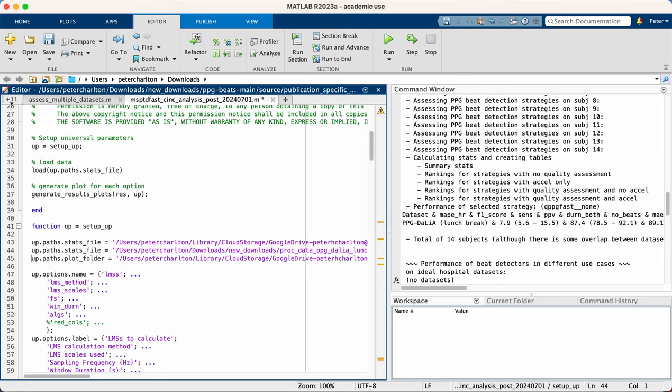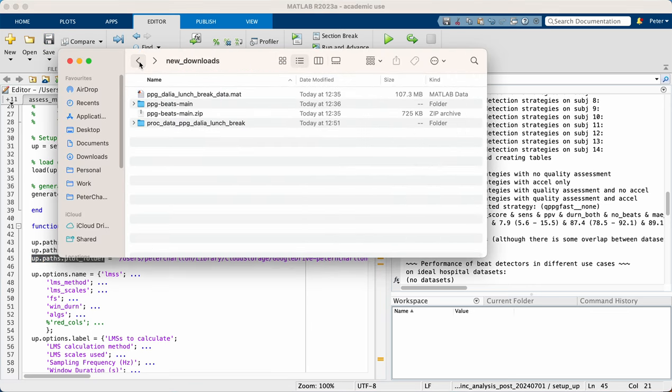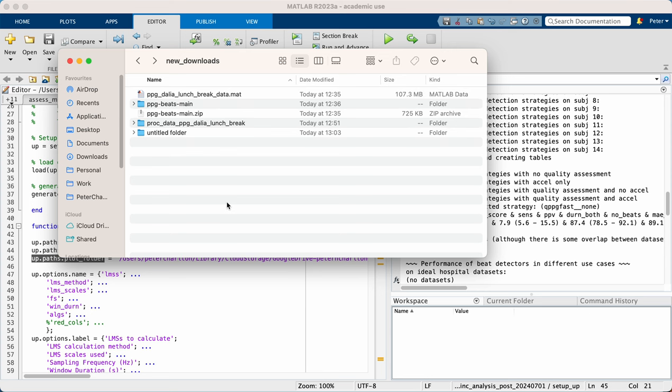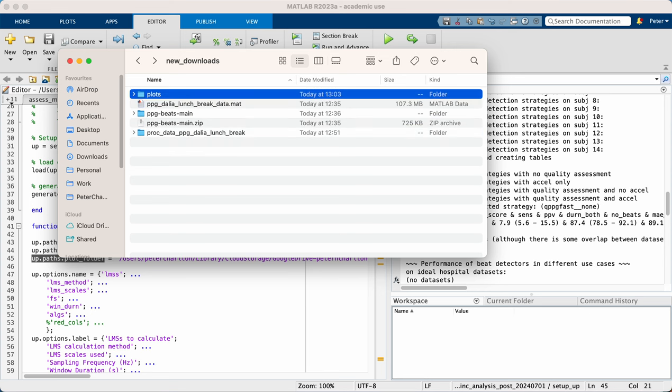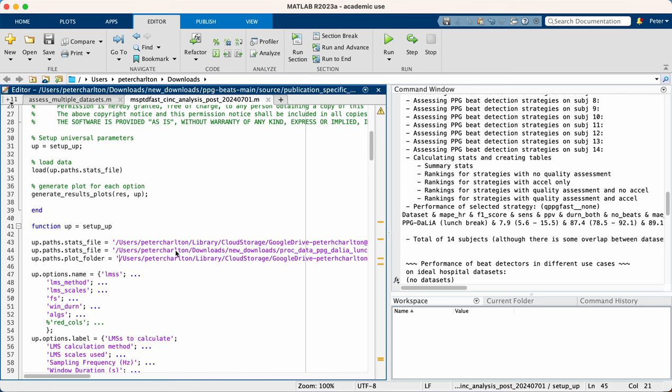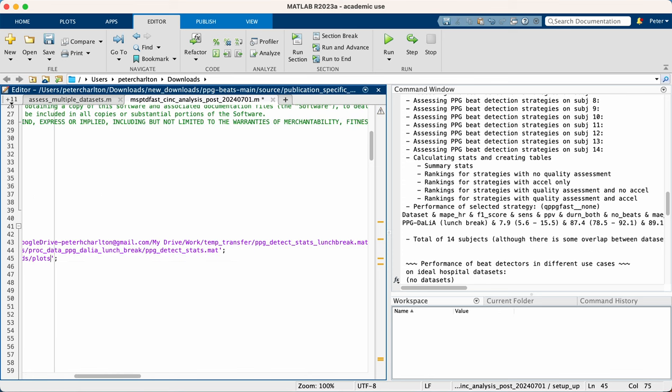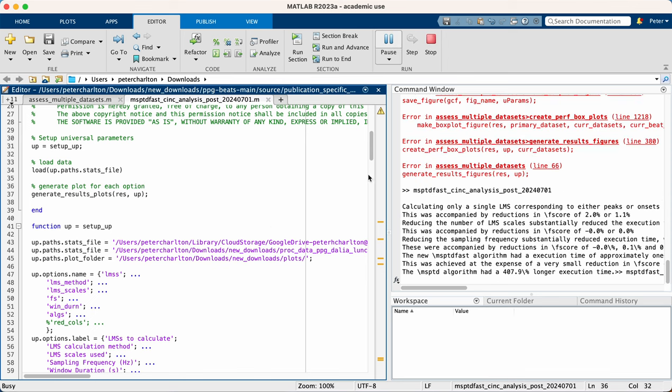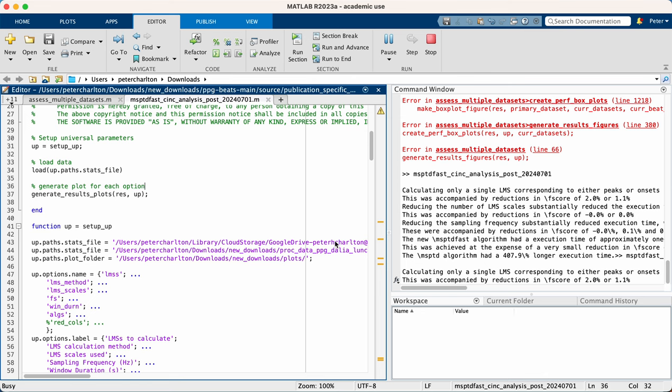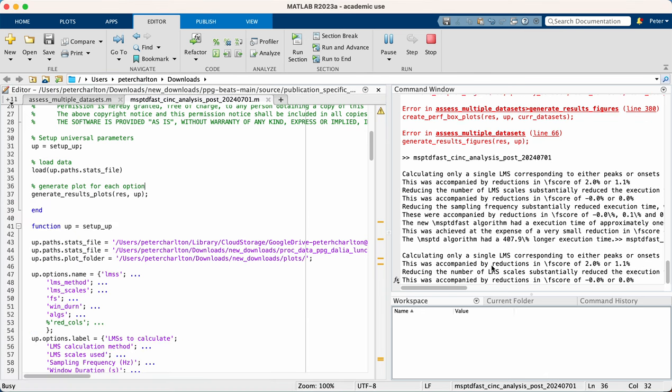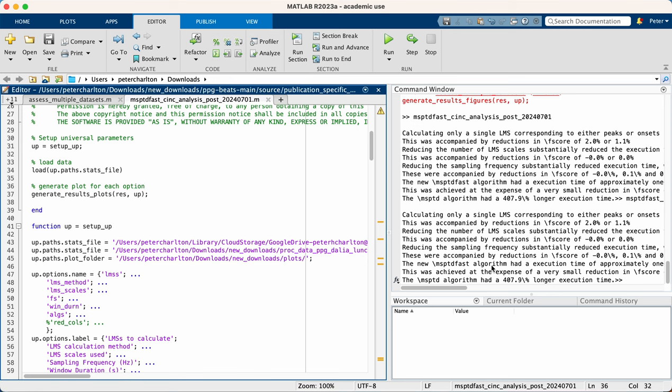And then secondly, there's also this path for a folder where the script will save some plots. So let's create a new folder. We'll call it plots. We'll copy the name of that folder, sorry, the path of that folder, insert it here with a slash at the end. And now we'll run this script, which will load in the summary statistics and then generate a series of plots and also output some performance details in the text.